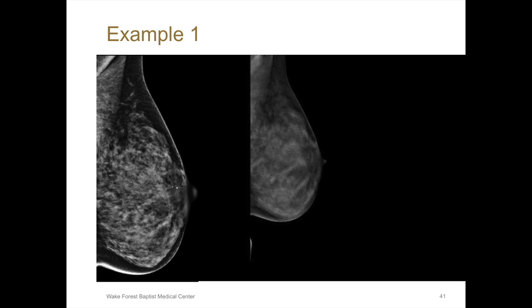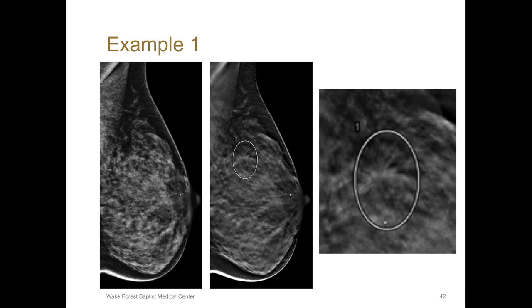So let's look at this patient here who came in for a screening mammogram, dense breast tissue, normal 2D mammogram. She got a tomosynthesis imaging done, and I'll draw your attention to up in this area here. And you'll start to see these little wispy lines. This is a slice from her tomosynthesis imaging showing these wispy lines coming from a central point. So she had architectural distortion and was found to have an invasive breast cancer. And we would have never known on her 2D imaging.